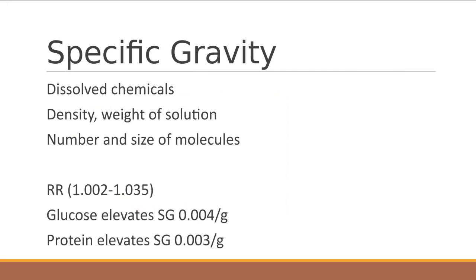Specific gravity is where we're talking about solute concentration. Your solute concentration is looking at the dissolved substances. Specific gravity is a good test to do, because what it's testing for is renal function and hydration. And then it's also helpful in determining whether or not your specimen is water, or if it is detecting some type of a contamination based on those results.